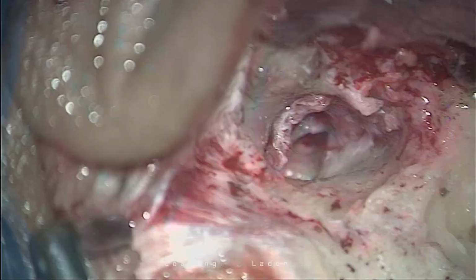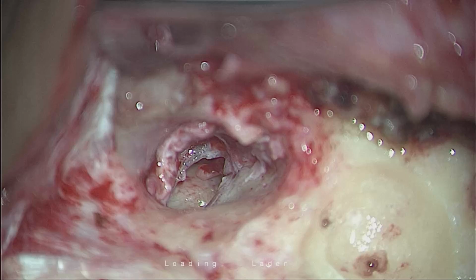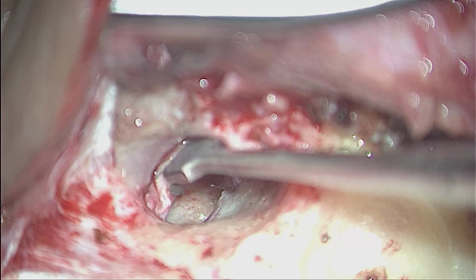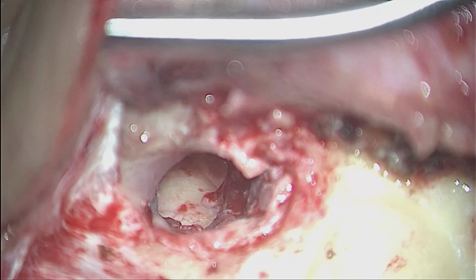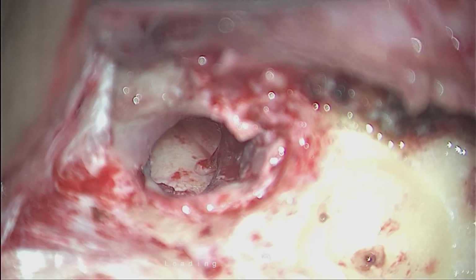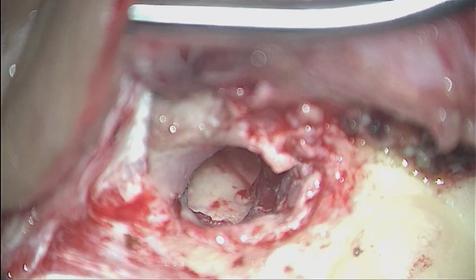We can do it indirectly by radiology or by endoscopy, but that can prove wrong, and we have found that proving wrong. So this is the test. It doesn't take more than a minute. See, in dry ears, how long did it take? Not more than a minute. We just found the patency so laterally.